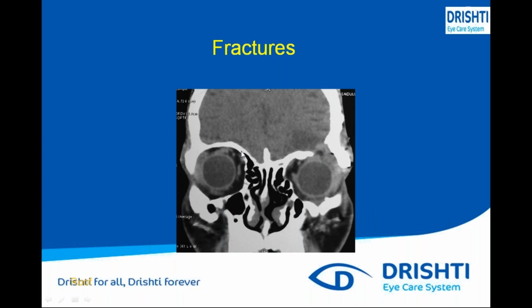So are you able to see the difference between these two eyes? This is the regular, and this, if you see, there is damage. So this is the orbital fracture. In this way, you need to differentiate from the other eye. Many times the artifact is there or the images are not so clear; in that case, you can always compare with the other normal eye. If the patient is complaining of swelling, redness, and you cannot clinically feel the bone with your fingers, in that case you can compare with this. So this is the orbital bone fracture over there.